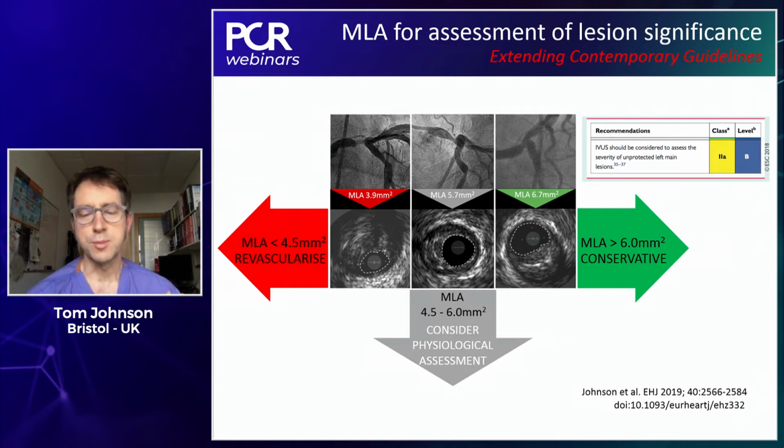And so I think the most important thing there is that you have the safety of both the imaging and the physiology to stop and involve colleagues, surgeons, your interventional colleagues, to actually discuss amongst a heart team how is best to proceed with a patient of this sort. And so those decisions can be deferred. And Javier showed beautifully at the beginning, deferral versus treatment in the setting of FFR positive, FFR negative offers very good outcome. The only other aspect I'd just mention is this difference between the 4.5 and the 6 on that table that Javier had on the previous slide.